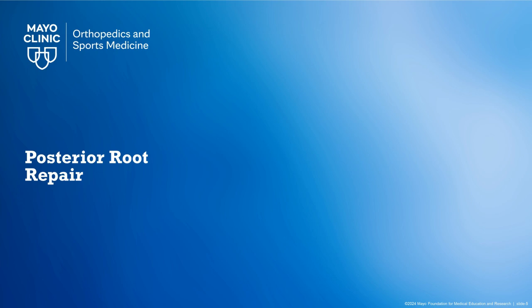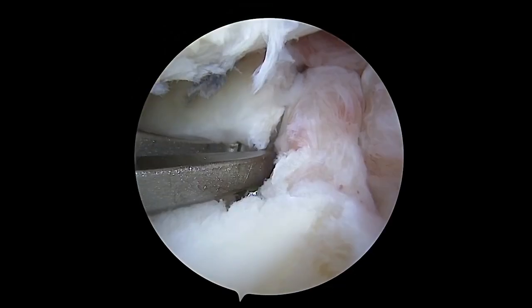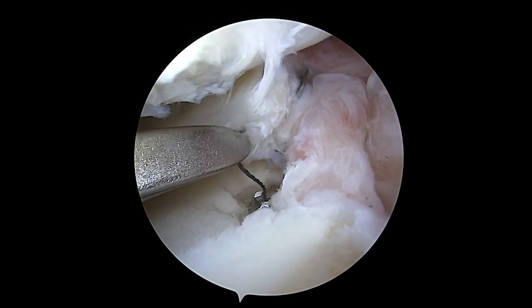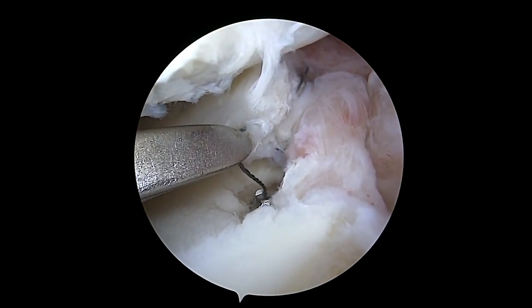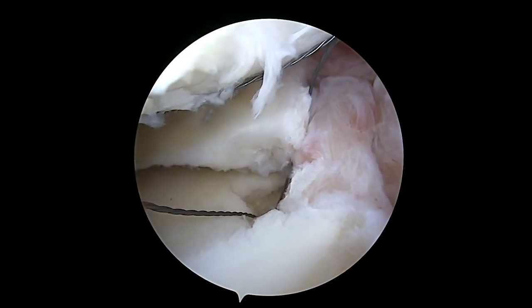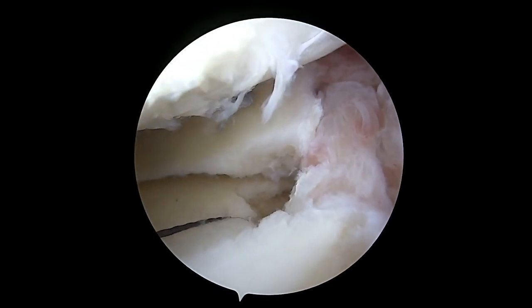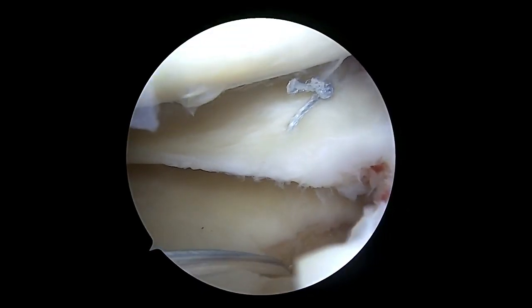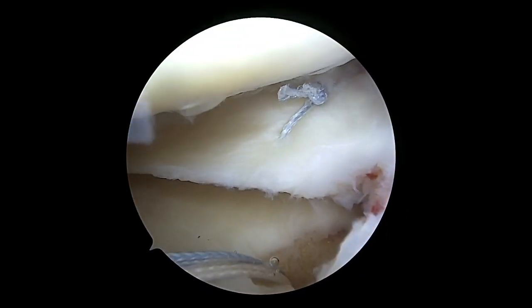Our focus is then turned to the posterior root tear repair using a traditional trans-tibial technique. A cannulated drill pin is drilled into the prepared anatomic site, and a wire is passed through the cannulated drill pin. The wire is pulled through the anteromedial portal and used to feed our root repair implant. We prefer to use the Arthrex suture lock implant for retainable fixation at the subchondral bone level. The implant is fed through the wire and into the drilled tunnel, and the anchor is deployed by pulling on the sutures.